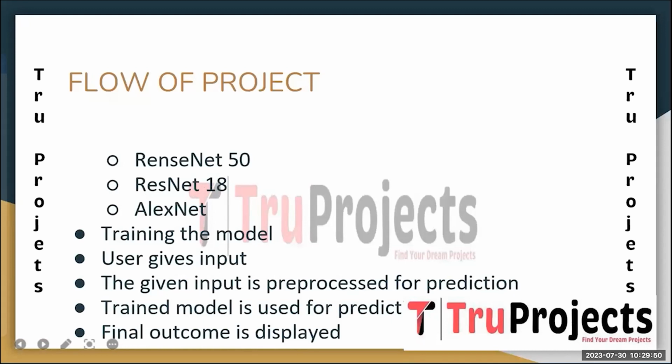And the next step is training the model. With the models selected and implemented, we proceed to train them using the training dataset. This step involves passing the training images through the deep learning model, computing the loss function, and optimizing the model parameters using techniques like stochastic gradient descent.